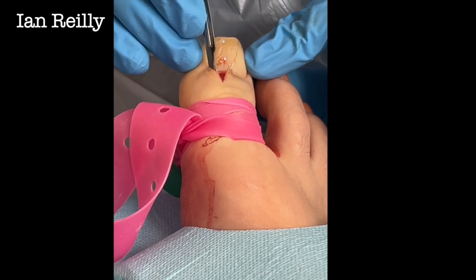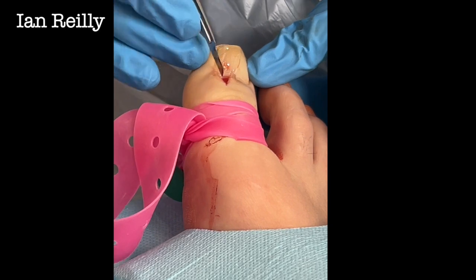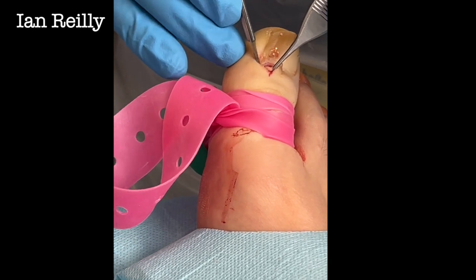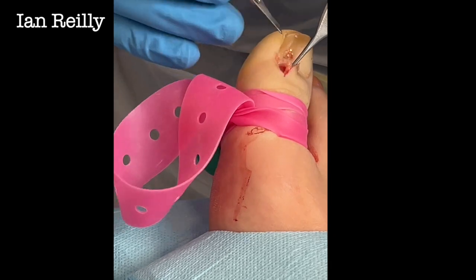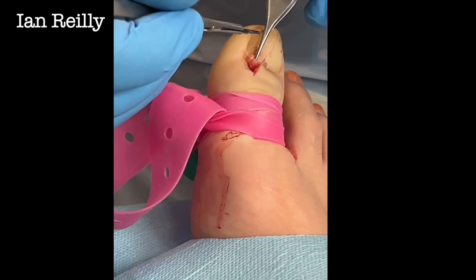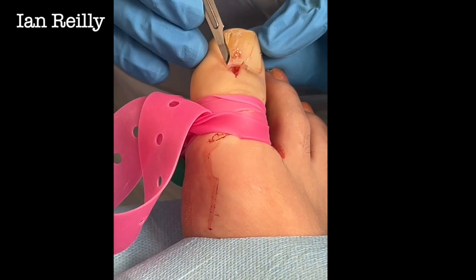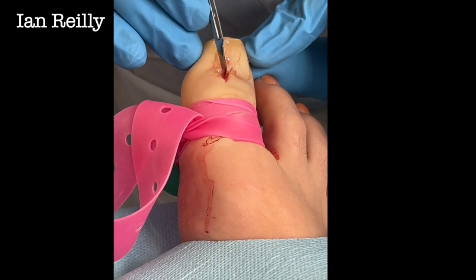That looks a little suspicious there, so I'm just going to tickle it out a little bit. You can see the nail is taking a bit of a battering from the lesion. That looks to me like it might be the base of that. And the rule of thumb — and you'll get this with any surgeon — is: if in doubt, cut it out. That's what we do. But that's all out now and it looks kind of nice and clear.